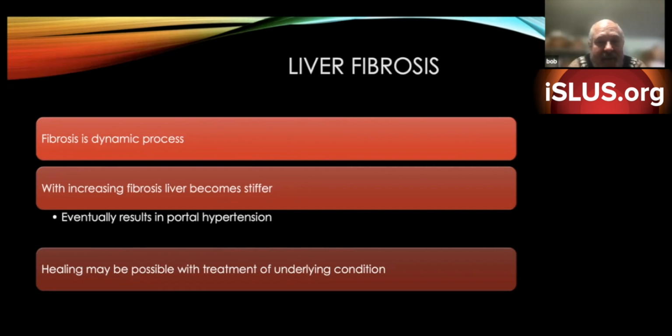Well, I got some images coming up, but basically we look at the flow direction. The portal vein and hepatic artery should both be flowing in the same direction, and that is into the liver. With portal hypertension, basically I say the hepatic artery becomes like a bully, so it gets into the liver, can't progress to where it wants to progress, and hits a dead end.